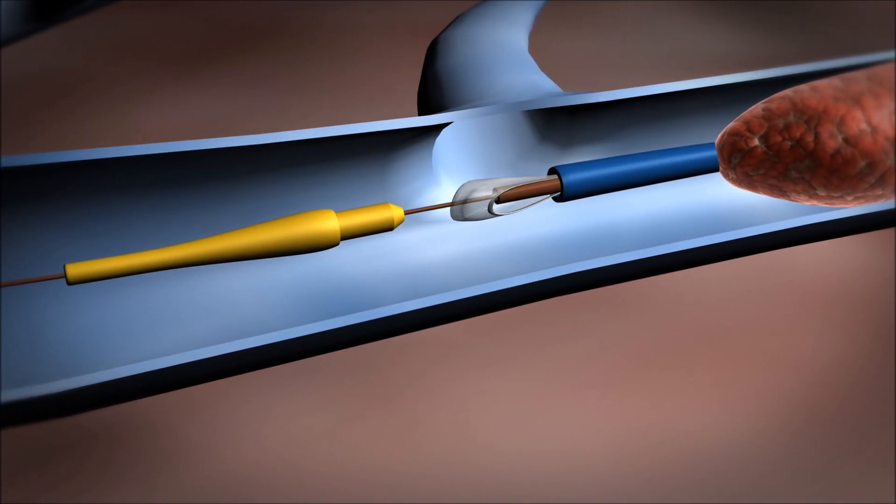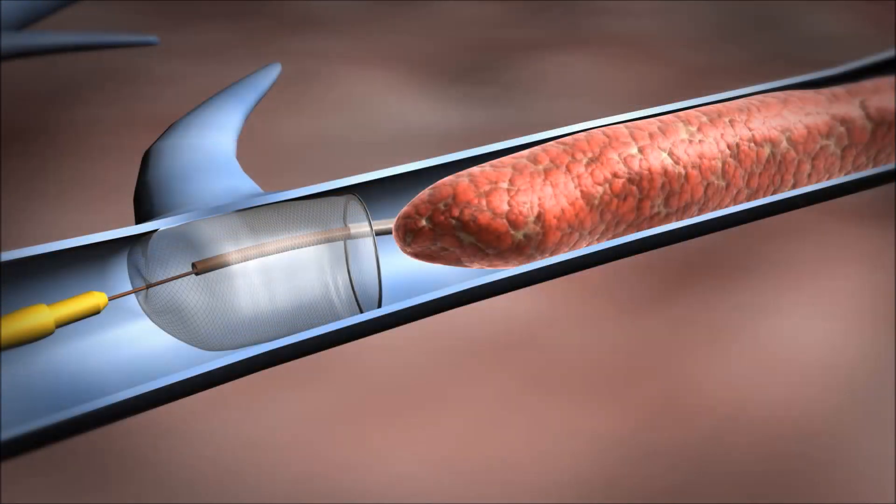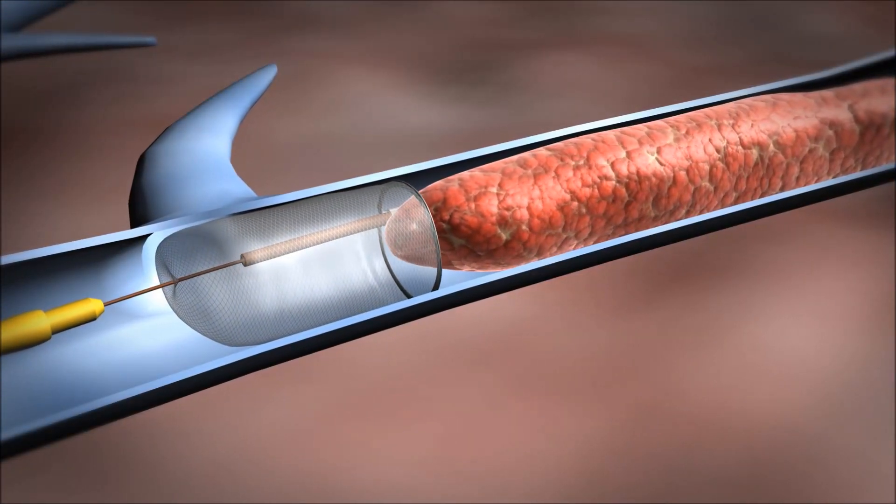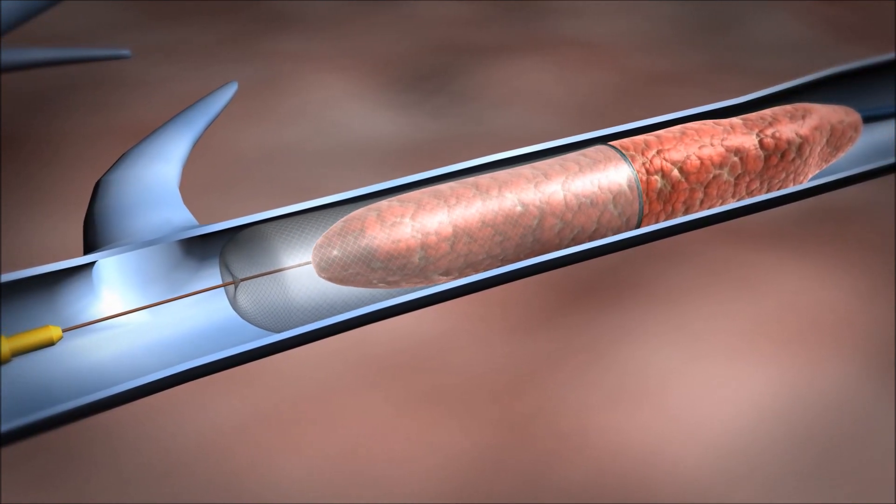Next, the outer sheath of the delivery catheter is retracted to deploy the proprietary Capere basket, which will capture the clot and provides distal embolic protection during the procedure.